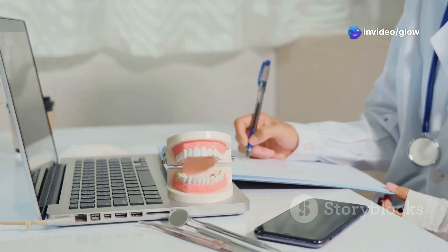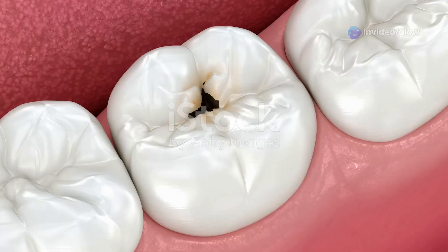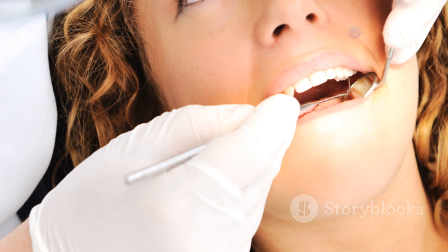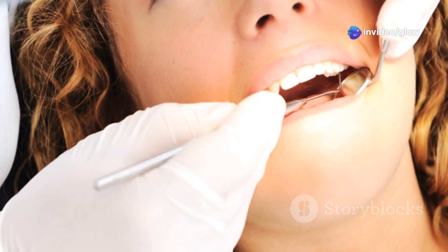First up, the goals of cavity prep. It's pretty straightforward: remove all the decayed tooth structure, get rid of weak enamel, and shape the cavity so it can securely hold the filling. And don't forget, it's all about preserving as much healthy tooth as possible while keeping that restoration resistant to chewing forces.